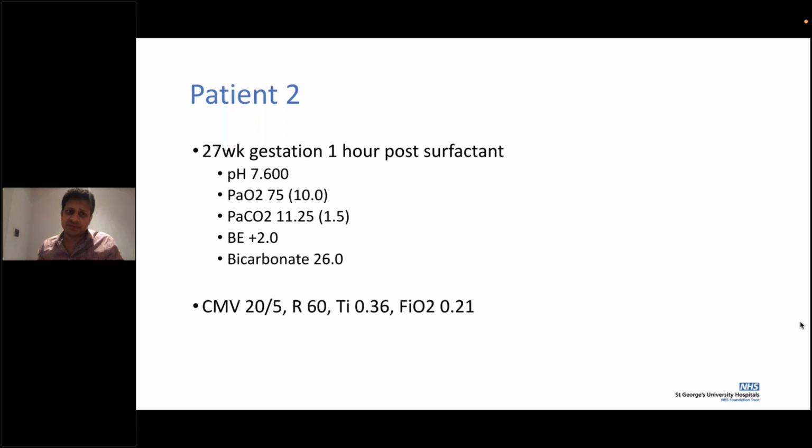So if you set it at 5 mils per kilo, the pressure will auto-regulate to deliver that 5 mils per kilo. In that case, you're not worried about whether it is 20 of pressure that I need, or 18, or 17. It may just be the baby needs only 14 or 15. In that case, you've done the right thing. The question is whether it should be a SIMV or PTV mode on a volume control. Now that's a questionable one.